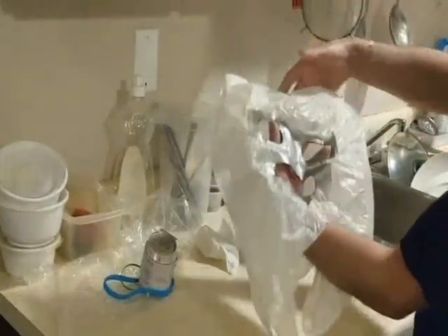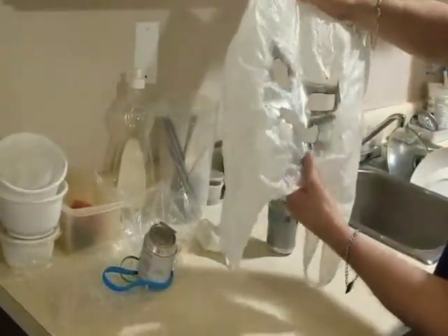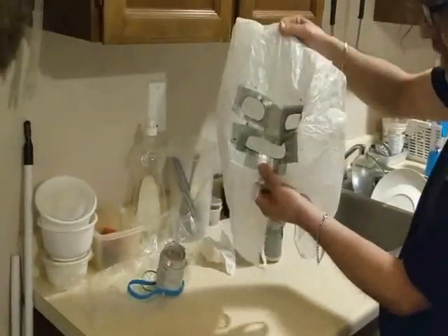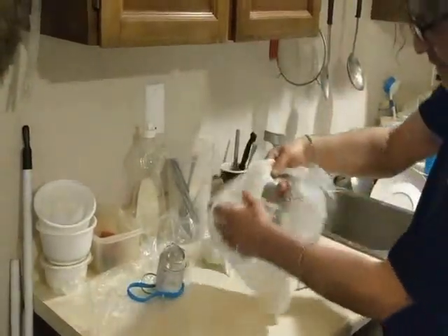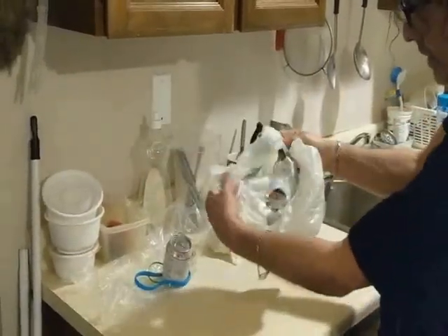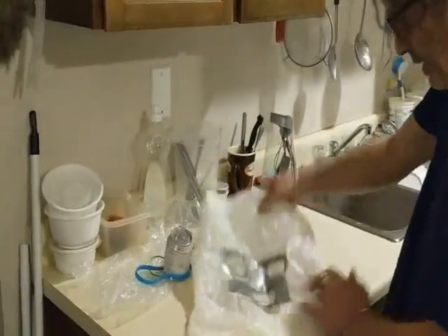Okay? Or ones that you get from a store, Safeway, whatever it may be. But make sure it's a decent one. As you can see, I've punched some holes in there, cut holes for the eyes and the mouth, and you'll see duct tape is on the inside and on the outside.